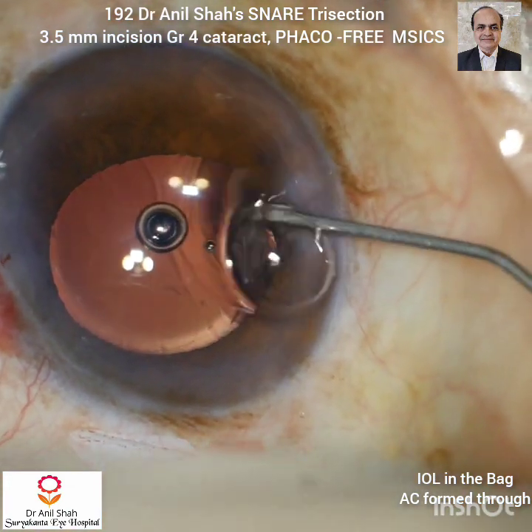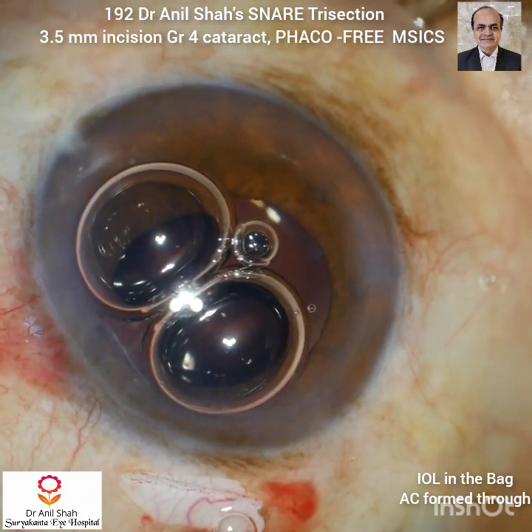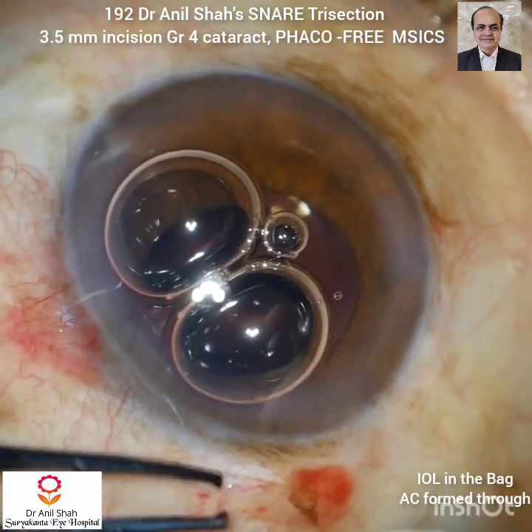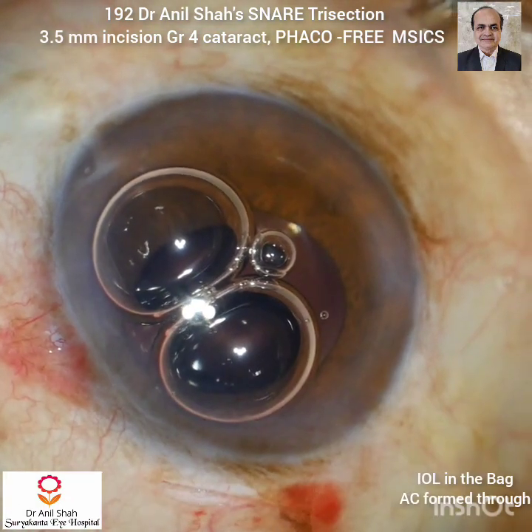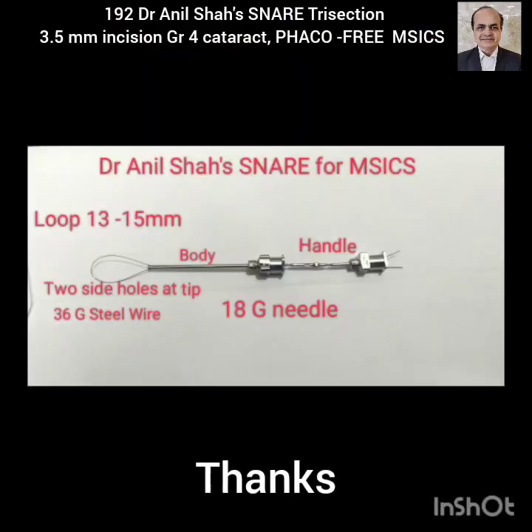I prefer a small air bubble in the anterior chamber. This is intracameral moxifloxacin. Now I will close the incision by covering the conjunctival flap. Thank you very much for your kind attention.